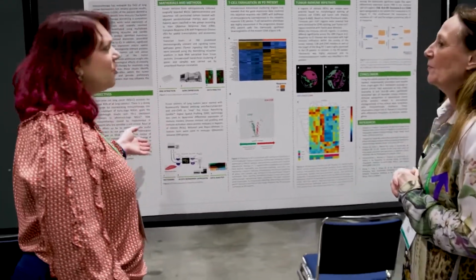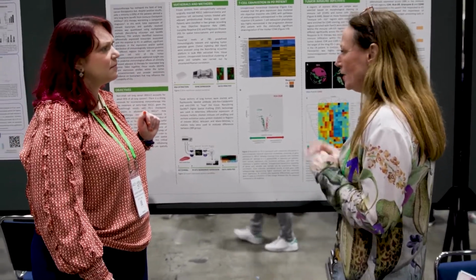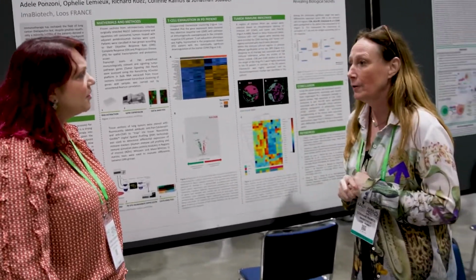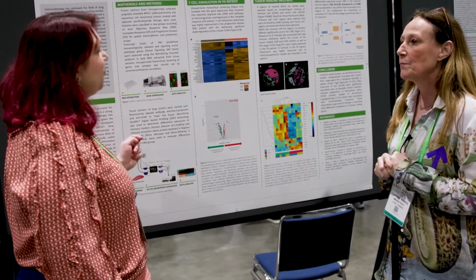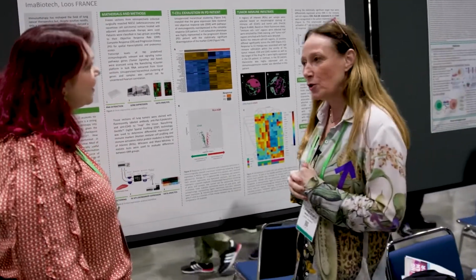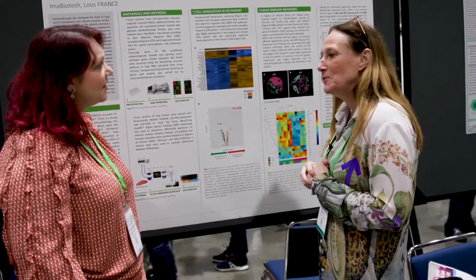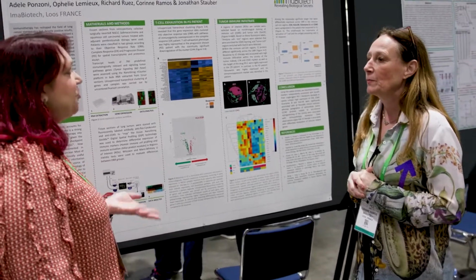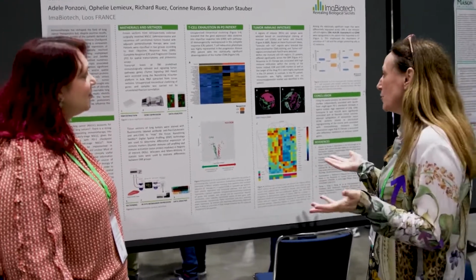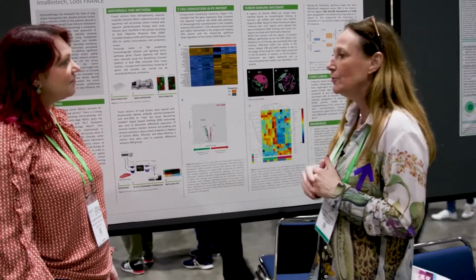Great. So what panel did you use for the nCounter analysis? For the nCounter analysis, I don't even remember exactly, I think we used the Tumor Signaling 360 panel. I see. So did you get the tumor inflammation signature scores as well? Yes, and this is something that I'm not showing here, but we had the tumor inflammation score within the patients that responded to the therapy. So I'm guessing the patient who responded probably had a higher score? Absolutely. We're not showing this in this poster, but we have looked at this very specific signature, which is included in that panel.